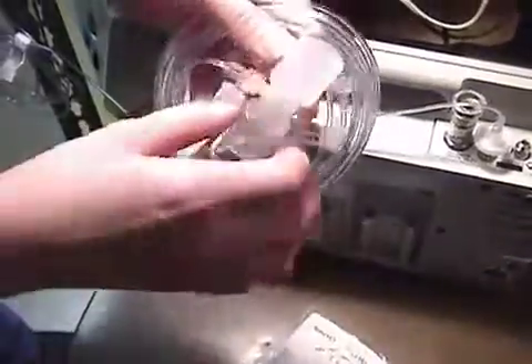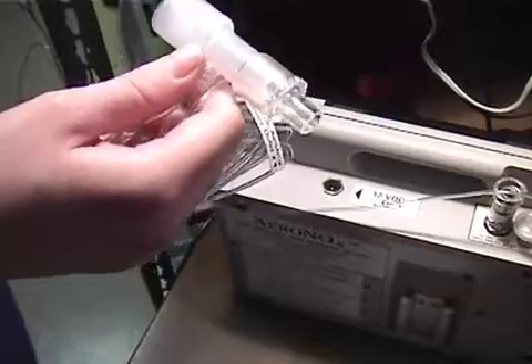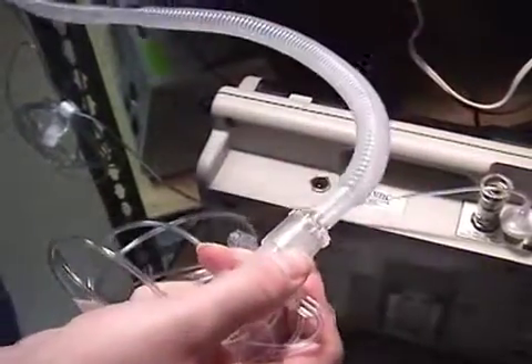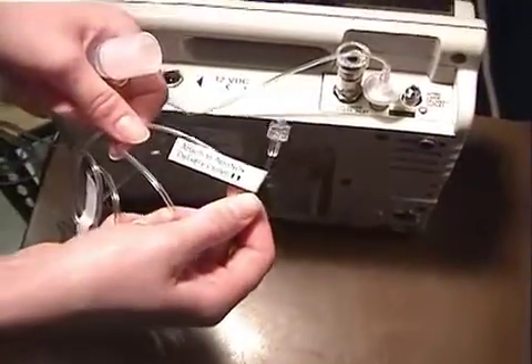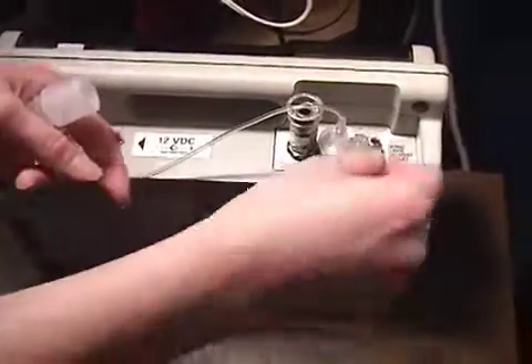Now you are ready to apply the delivery line to the circuit. As with some vent circuit setups, you may need to apply additional adapters to size down to the inspiratory side of the ventilator circuit. Next, apply the delivery line to the port on the Aranox unit.